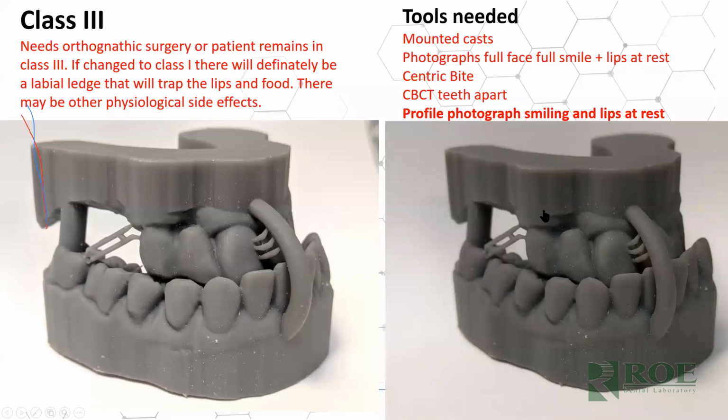Other common situations, class 2, class 3, severe class 3 and 2, especially class 3, we see this often. And, for these patients, we don't diagnose, we're the laboratory, but what we have seen over the years is sometimes these cases, the patient wants normal occlusion, maybe the dentist wants normal occlusion, and it might be possible, but we run into situations, as in we end up having to open the patient up maybe too much to get room for prosthetics.